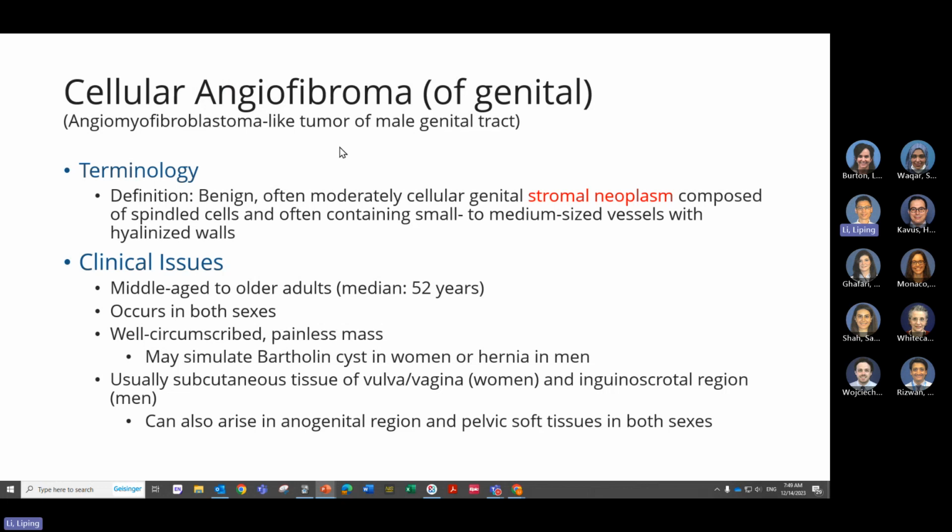That is from dermpath, aka fibrous papule. That is an angiofibroma. And then we have one from soft tissue. We call this angiofibroma of soft tissue. And then also we have one in the ENT, that's the nasopharyngeal angiofibroma.